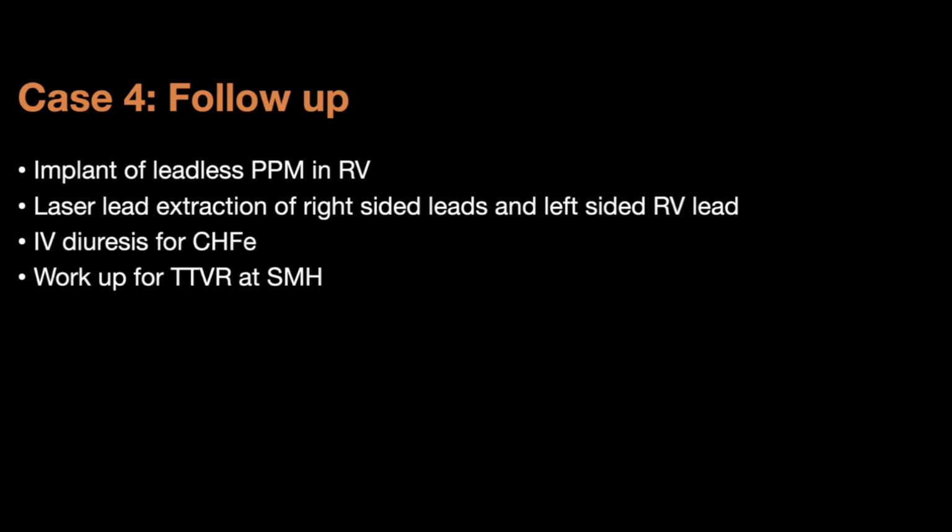Okay. It's very helpful. So Bean suggests that we should use the 3D probe for the online audience. Well, why would we use the 3D probe? How do we use it? If you're using a 3D probe, nowadays we have lots of features that come with the 3D probe. You don't have to keep switching to a standard probe. I see. Okay, got it. So the message to the audience is if you have a 3D probe, you can actually use flipping different views as well as using the X-plane to look at the mechanism or, I guess, the morphology of the tricuspid valve.